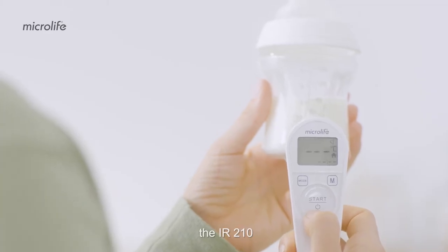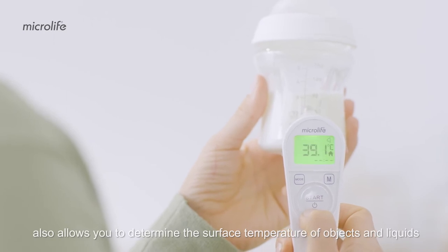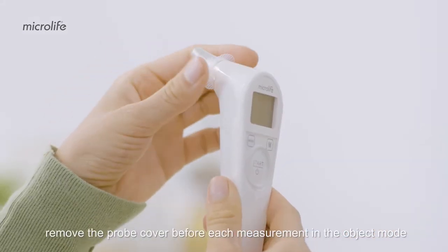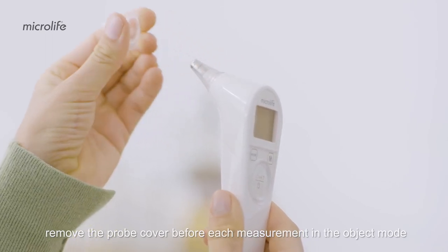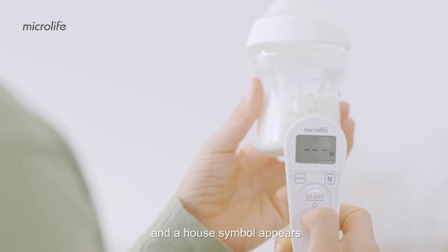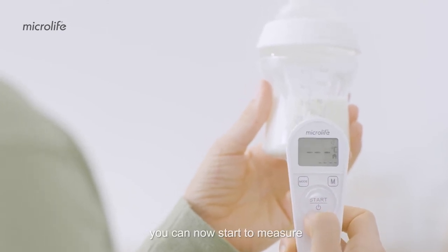The IR-210 also allows you to determine the surface temperature of objects and liquids. Remove the probe cover before each measurement in the object mode. Then press the mode button and a house symbol appears. You can now start to measure.